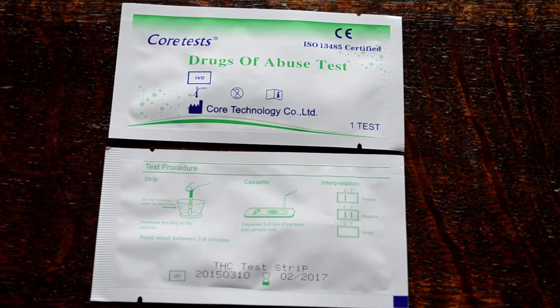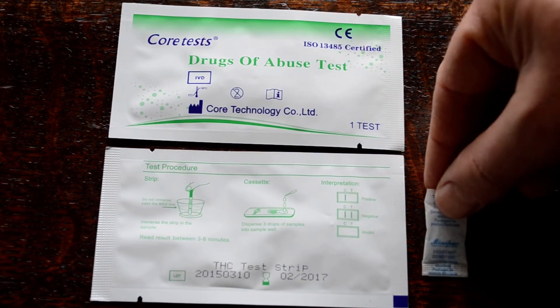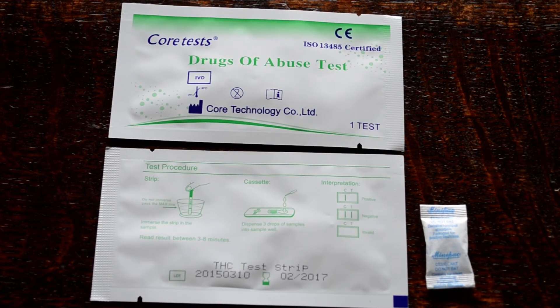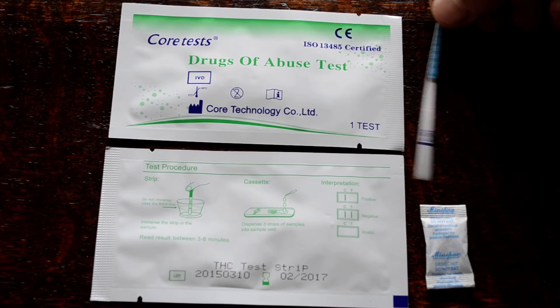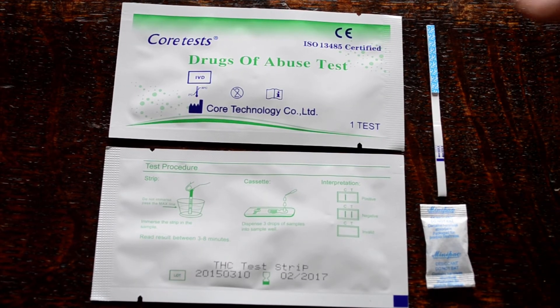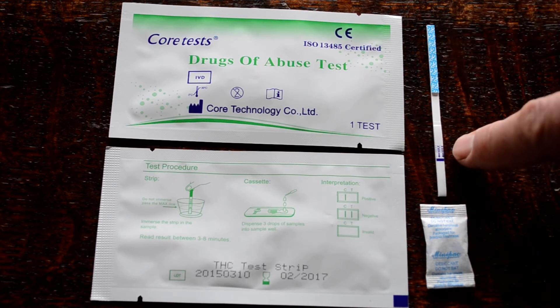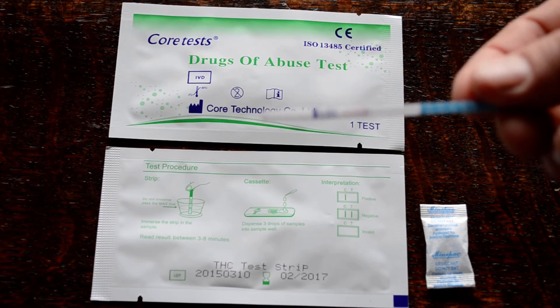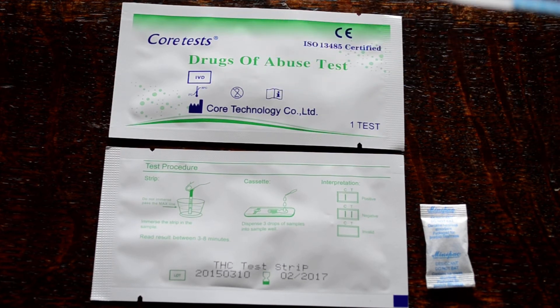When you open the foil you will be presented with a desiccant pouch. This is just to keep the test strip completely dry. This is the format for the test strip that's in the foil. You'll see it's a standard 3mm test strip with a handle end, a dip end with a maximum dip line indicator, and a flat central section. When you're ready to do one of these tests, it's a very simple procedure.